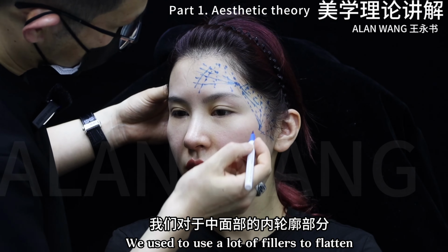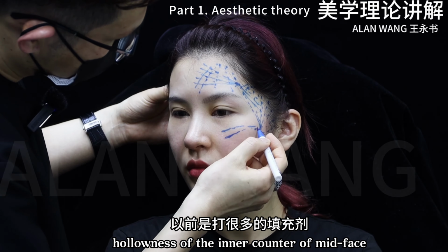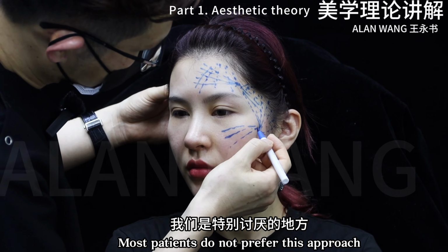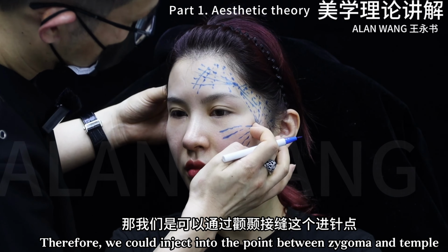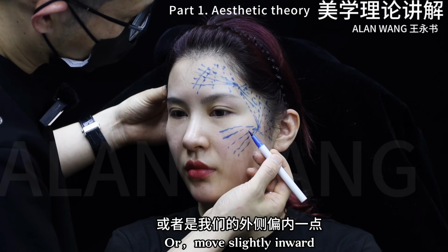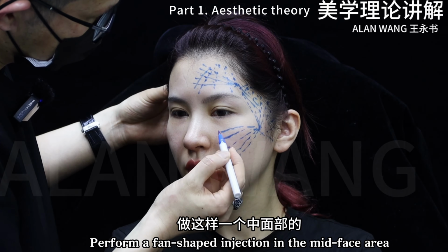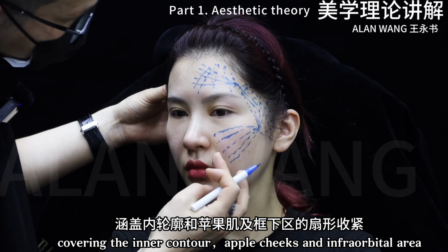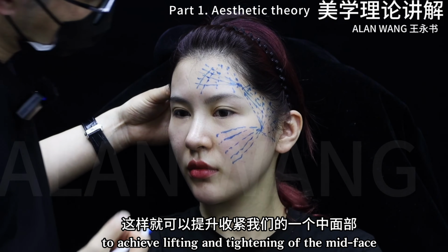Apparently, we used to use a lot of fillers to flatten hollowness of the inner contour of the mid-face. Most patients don't prefer this approach. Therefore, we could inject into the point between the zygoma and the temple, or slightly more inwards. Perform a fan-shaped injection in the mid-face area, covering the inner contour, upper cheek, and infraorbital area to achieve lifting and tightening of the middle face.